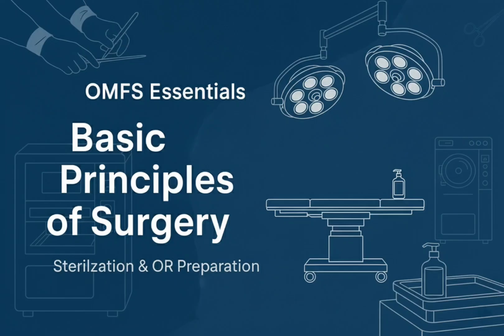The rationale: a drain acts as a two-way conduit. Bringing it through the main wound invites bacteria into the surgical site, guarantees an infected wound, and prevents the primary closure from healing properly. Gravity versus suction. Passive drains, or by gravity, drains like corrugated sheets must be placed in a gravity-dependent position to be effective. Active drains, or by suction, vacuum drains are highly effective and can be placed in a non-dependent site, i.e., uphill, because the negative pressure actively pulls the fluid out.